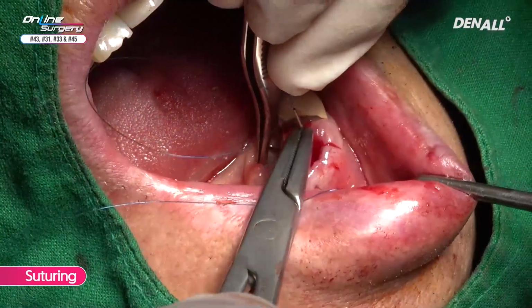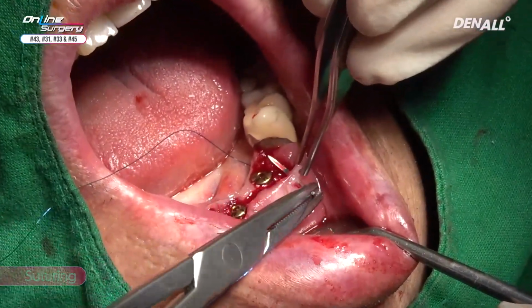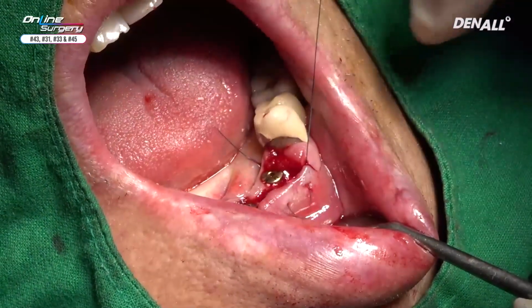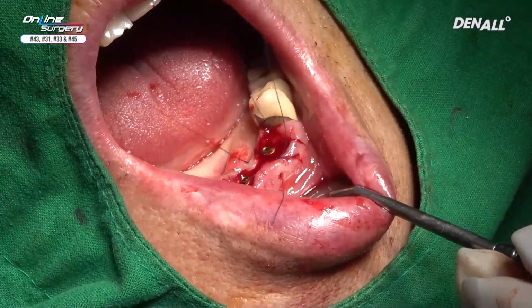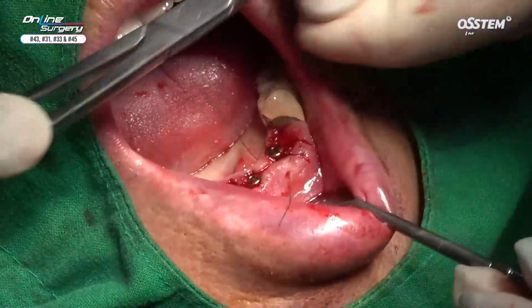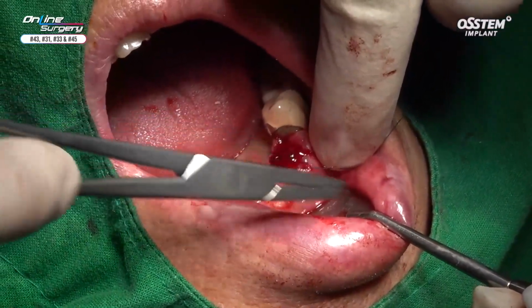I'm going to cover using hidden X method. You do not need to use a collagen membrane on top of a collagenated bone graft material. Healing occurs very quickly. In this case, you can just use a figure of 8, but to really support the graft material.